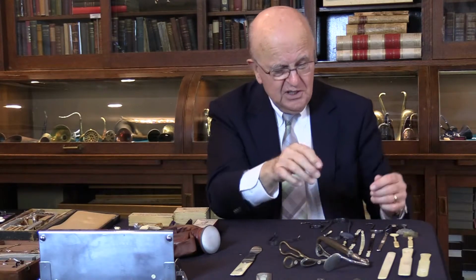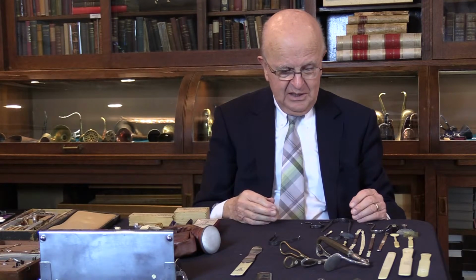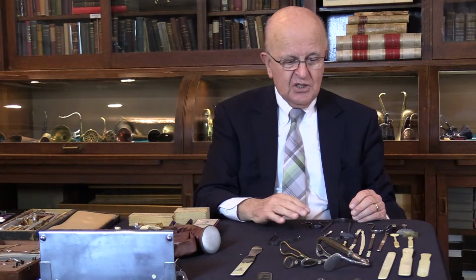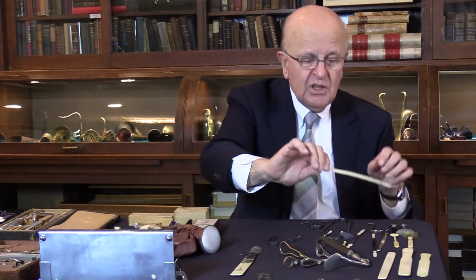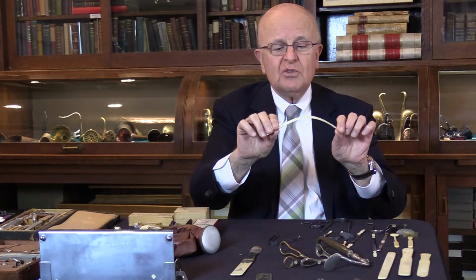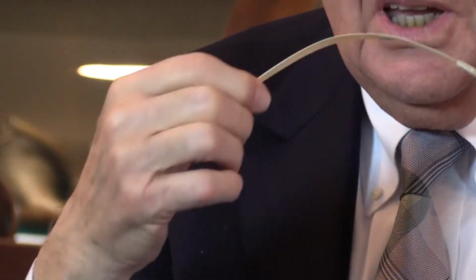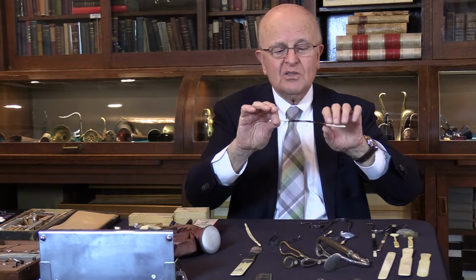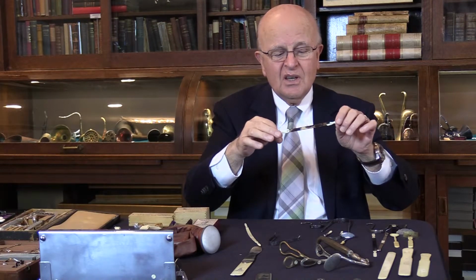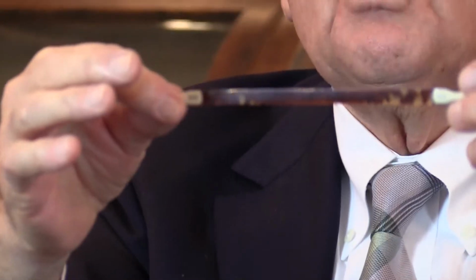I'm also fascinated by the tongue scrapers. This was a big thing, and I want to show you some of the examples that we have at the museum here. Some of the earliest ones is something like this. I'm not going to bend it too much because this is ivory. So you will bend it to about this way, and then you scrape the tongue with it. Another one, the same thing, you bend it. This is more of plastic. Same example, the plastic one, you just bend it.